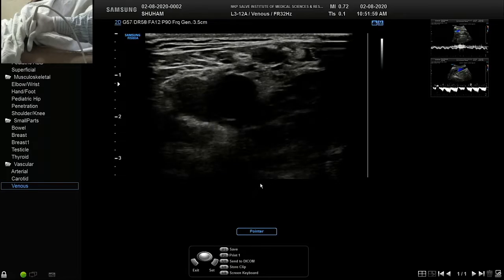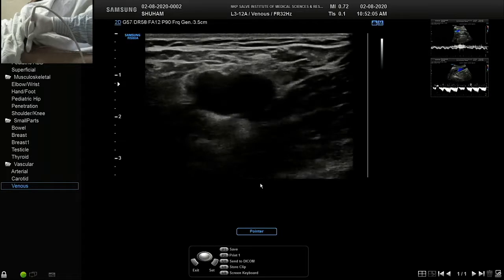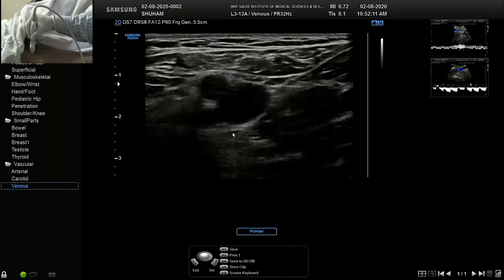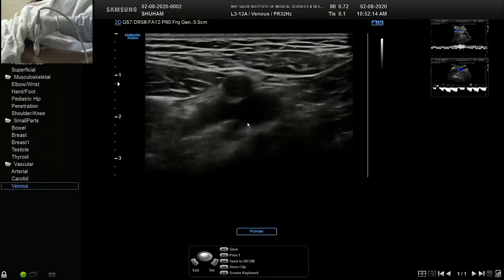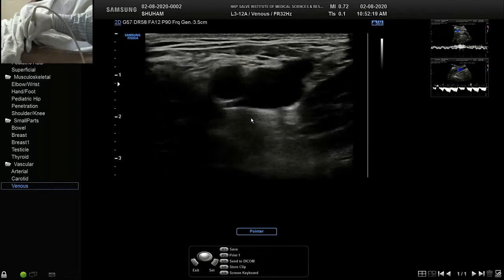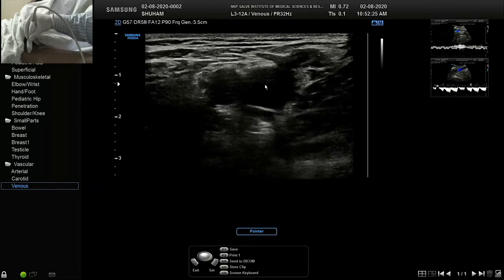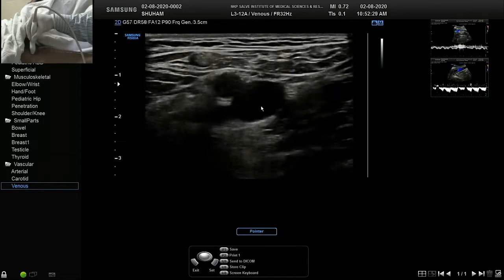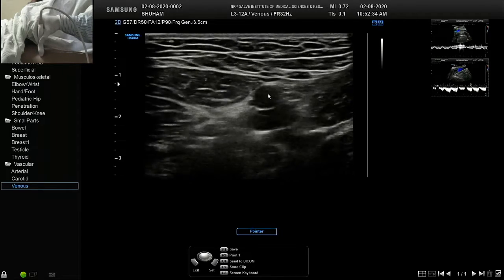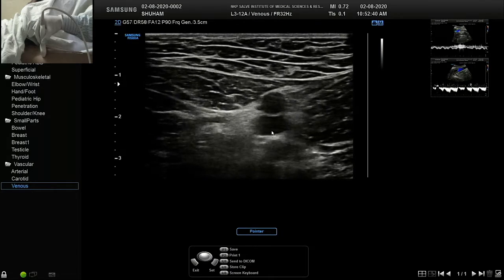We know the junction here. Junction assessment we will do a little bit later. If you come down, what happens is the artery bifurcates first, and the joining of the deep femoral and the superficial femoral vein comes at a lower level. So that we should know, and that makes us use while scanning patients. So this is the common femoral vein, that is the junction, and there is a confluence. You can see this is the superficial femoral and the deep femoral going this way, and now the femoral vein and artery will have a constant relationship till the mid thigh or lower thigh region.